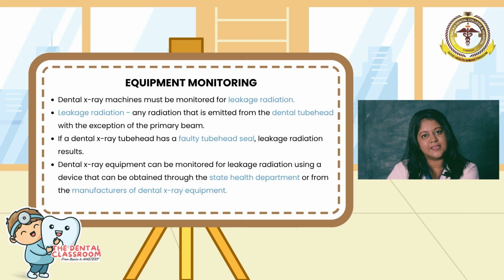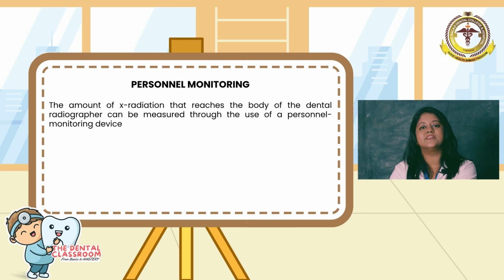So, how can this leakage radiation be corrected? There is specific equipment available for this purpose, which can be obtained from the manufacturer of the dental X-ray equipment. So, it is important that you monitor these machines constantly for leakage radiation, hence preventing unnecessary radiation exposure.